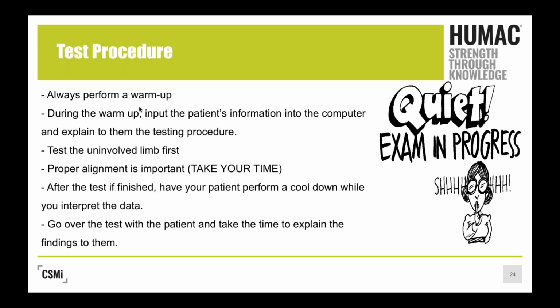All right, so here's the thing about that. Let's say it's early in the process, 12 weeks out of an ACL. Tell them what to expect. They are not going to meet return to play parameters at 12 weeks out. That way, this athlete's not going into it with unrealistic expectations.